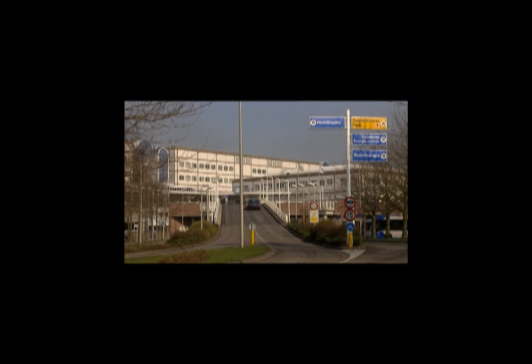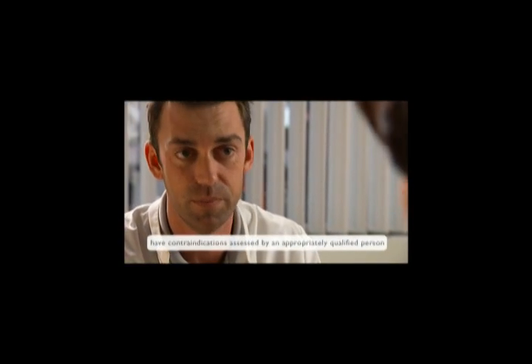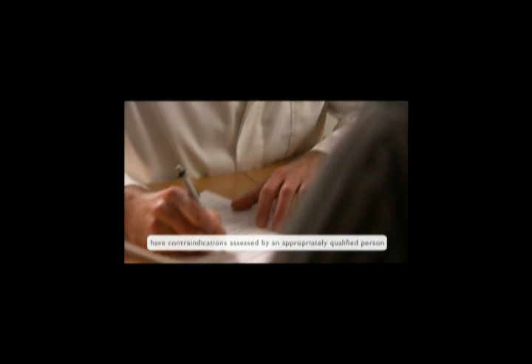Contraindications. Contraindications are conditions that might pose a hazard to the patient. They must be assessed by a qualified person prior to the examination.